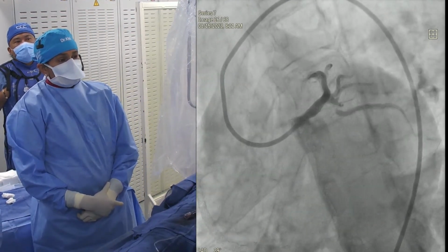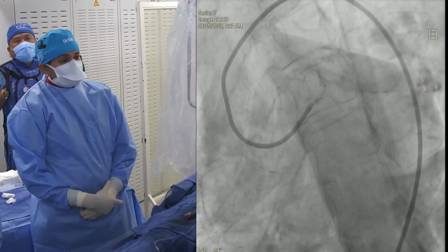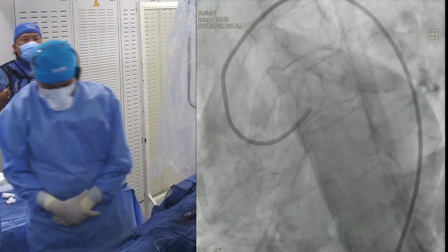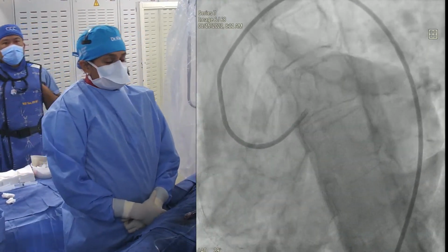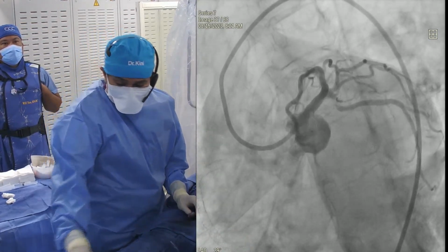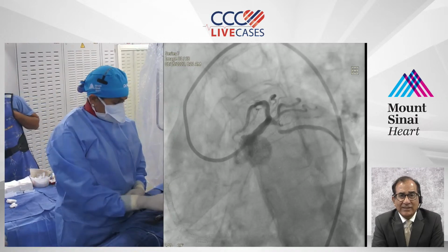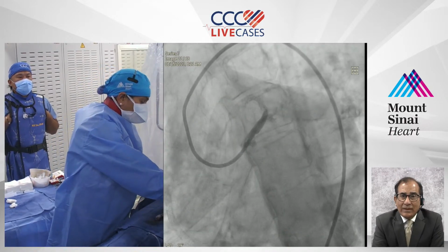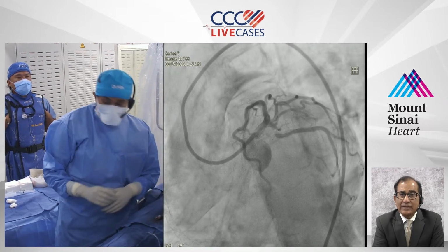So left main is non-obstructive, and then you have the LAD, which is again non-obstructive, with a lot of calcium. But look at the significant disease of the proximal circ. Anu, with all the incredible lesions I have seen you do with Rotablator, I have never seen you attempt this angulation. There is an archived case that we did for India Live. Yeah, that one.